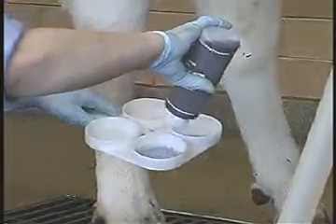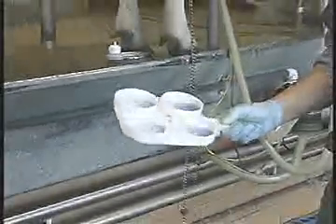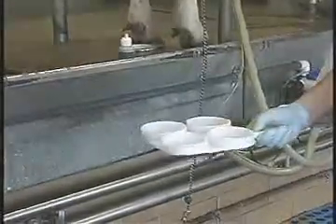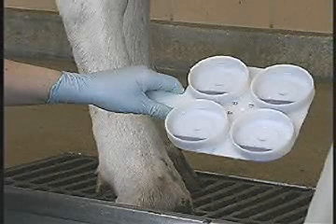The paddle is then rotated in a circular motion to thoroughly mix the contents. The mixing should not last more than 10 seconds. The test must be read quickly because the visible reaction tends to disintegrate after about 20 seconds. The reaction is visually scored depending on the amount of gel that forms. The more gel, the higher the score.